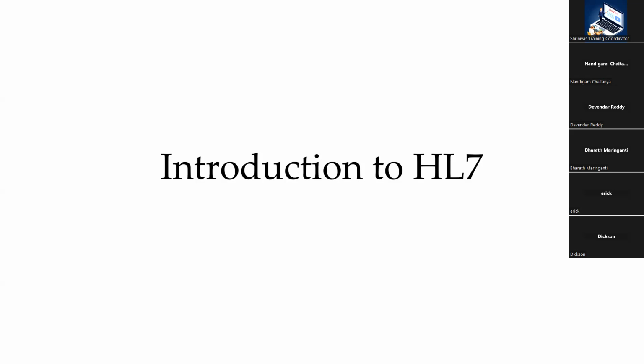So we'll go ahead and get started today with the introduction to HL7. Today will be the first session for going through HL7. This training session is divided into three different parts. First part would be understanding about HL7. What is HL7? Why HL7? What are the message types that we have? We will go through the most frequently used industry use cases of HL7.